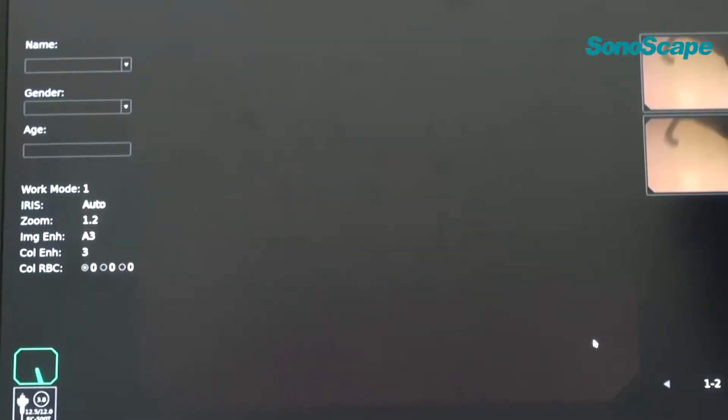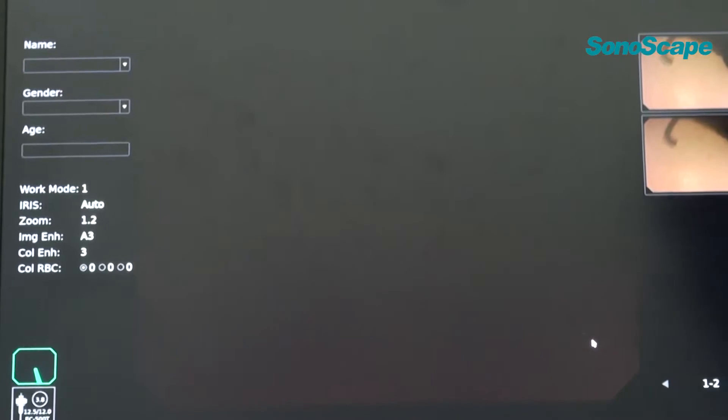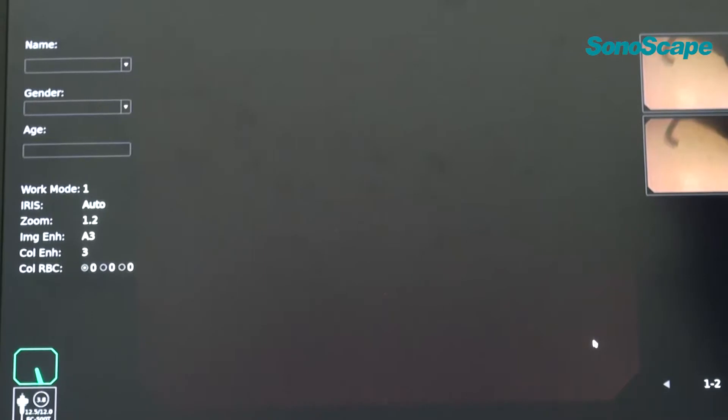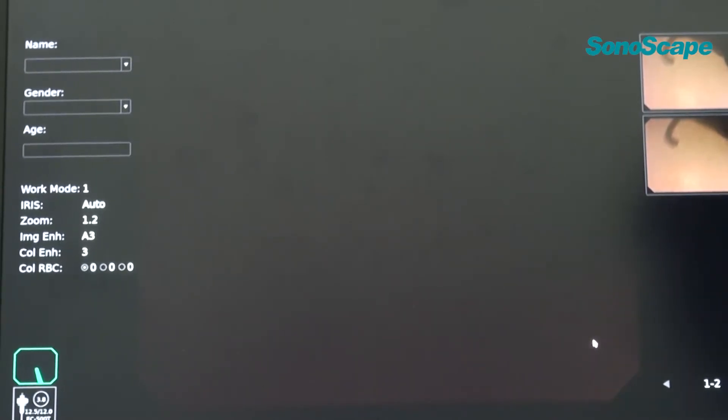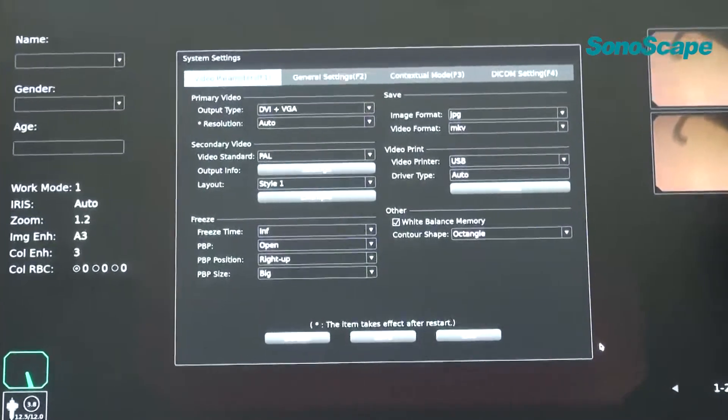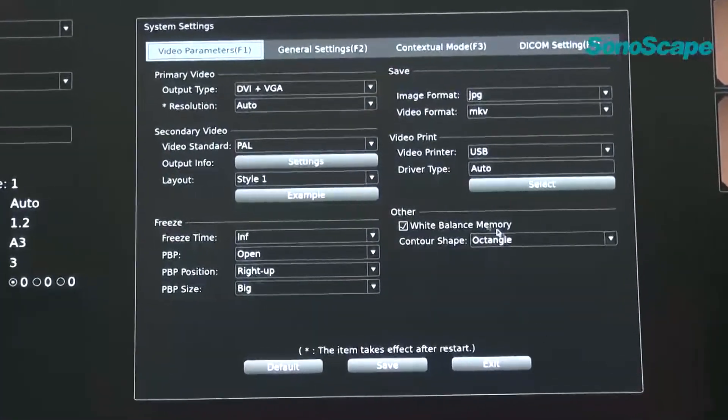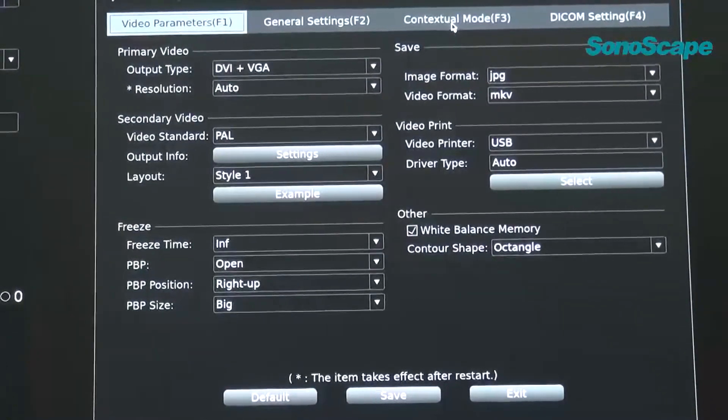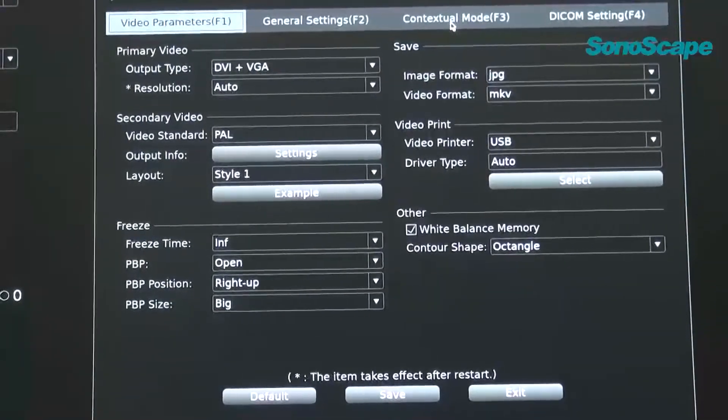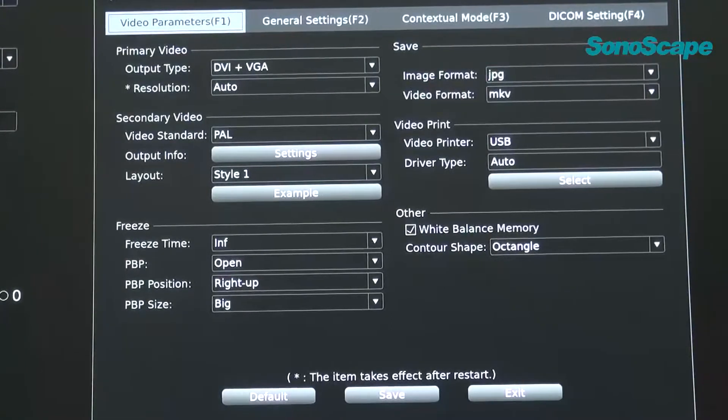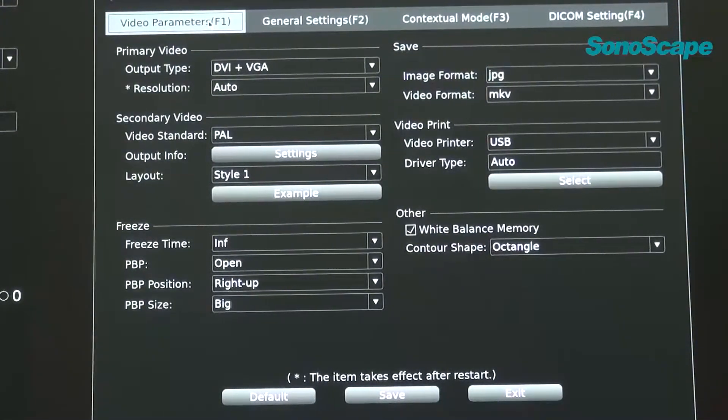Finally, we will talk about how to customize the system settings and how to deal with the report edition and printing. First, for the customizing the system, we will press F1 on the keyboard to enter the set interface. In this interface, four of the tape pages are available. The video parameter page is displayed by default.